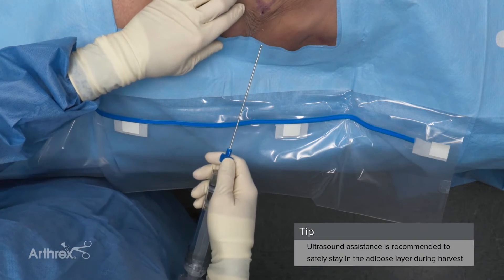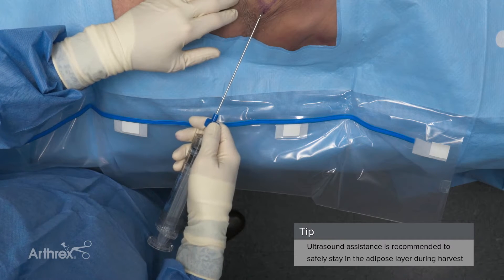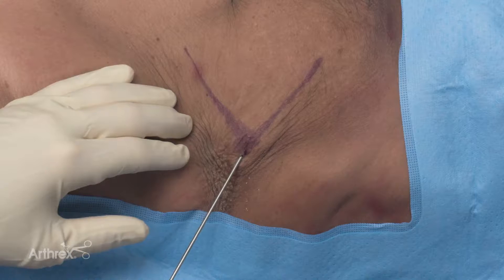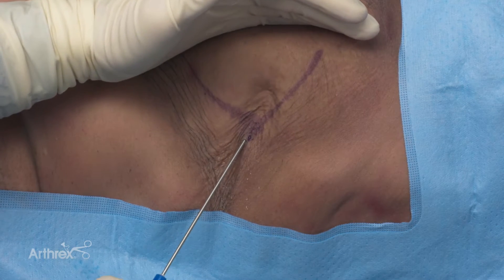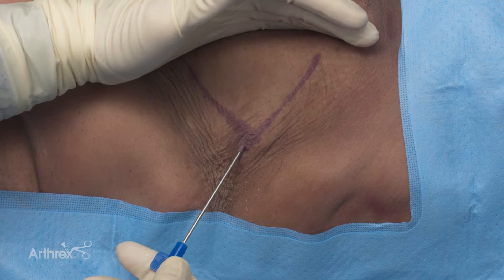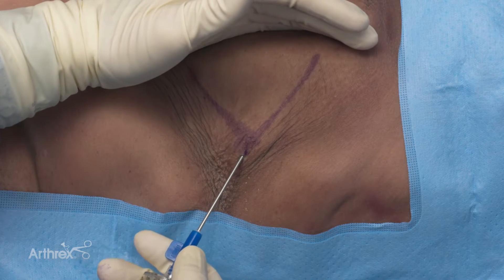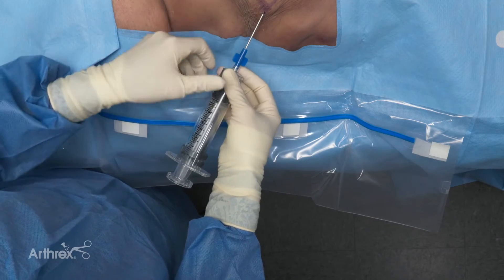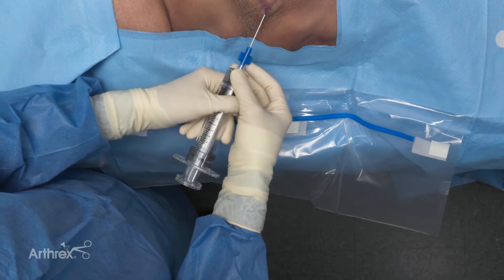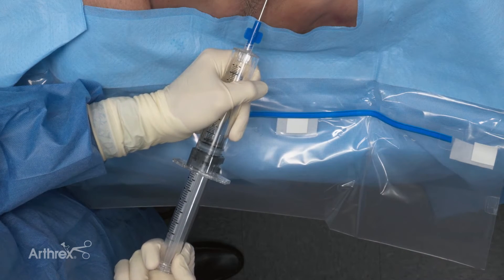So we're ready to begin our harvest. We're going to insert that 14 gauge caraway cannula into our incision site, same plane, still sitting in the horizontal plane, using our free hand as our barrier. Once we've advanced that cannula about 50% of its depth we'll be well seated in that adipose layer. I just want to take my free hand back, stabilize the outer portion of the device, and then find that top syringe.